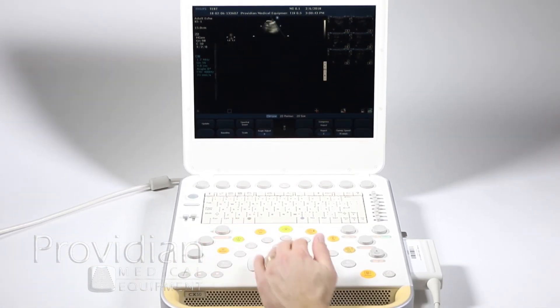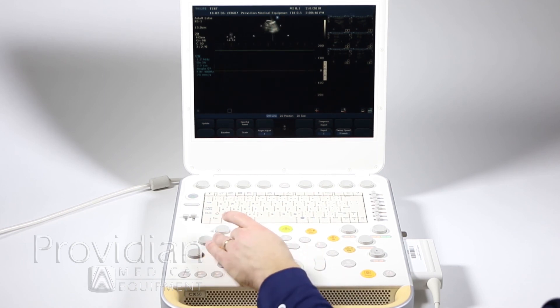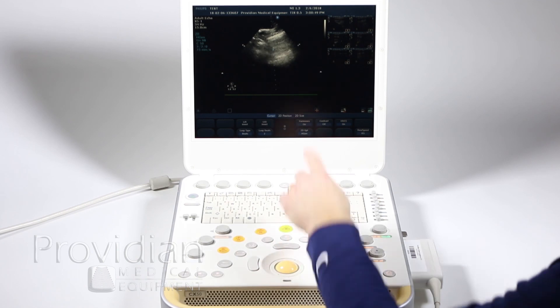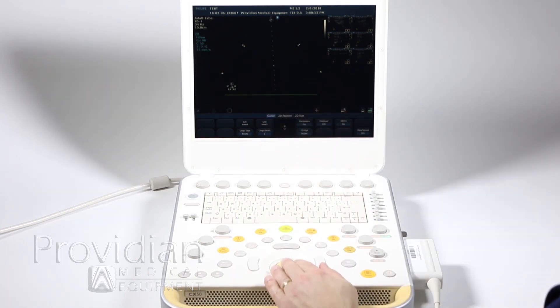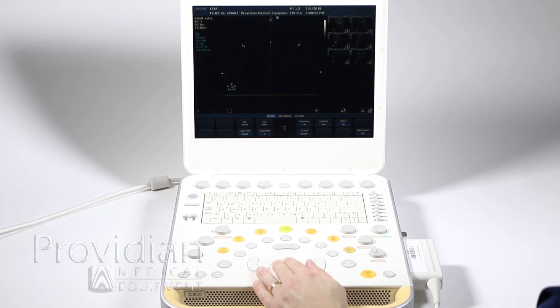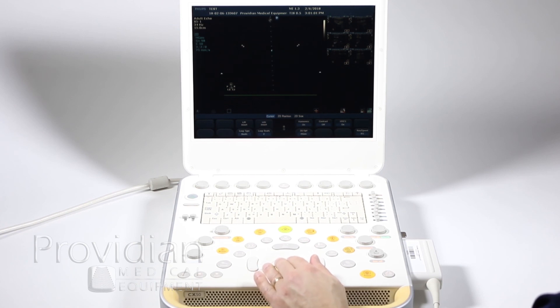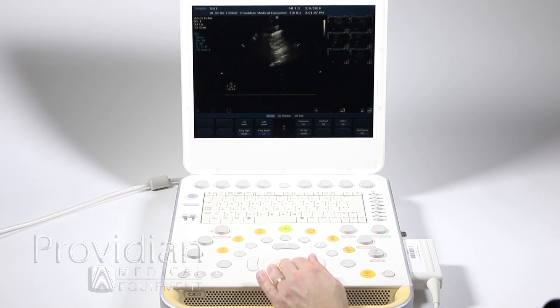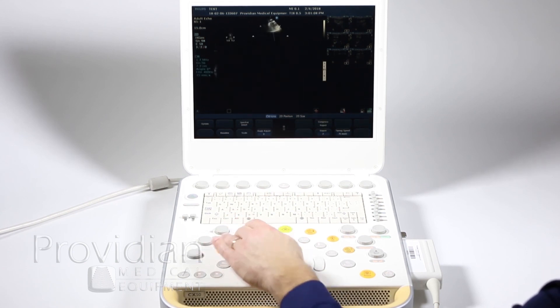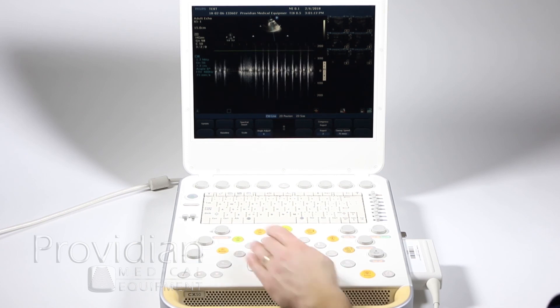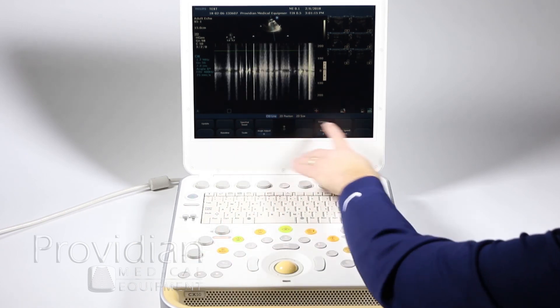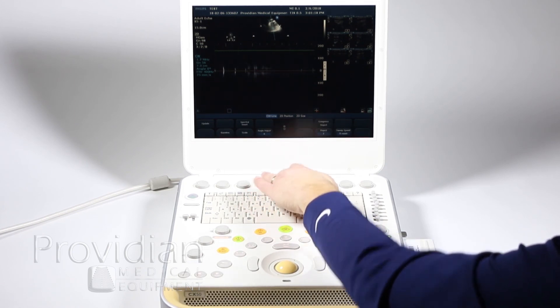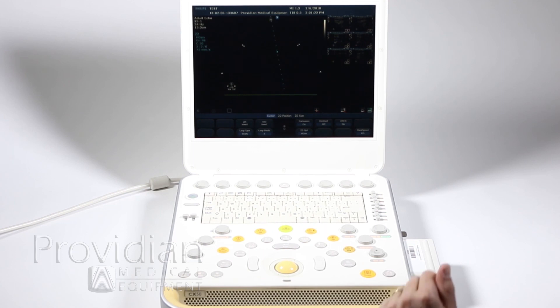Finally, we have CW Doppler. It works the same as PW. Let's go back to the 2D image — you can see this little blue dot in the cursor. I can move it up and down. That's where we put the CW Doppler cursor, which acts as a microphone indicating where it's going to be. Once you've got it positioned on your image, go ahead and hit CW Doppler and it jumps right into it. Much of the controls are the exact same as you would find in Pulse Wave Doppler or other modes. And that's it for Doppler and M modes — next we'll get into image review and reports.